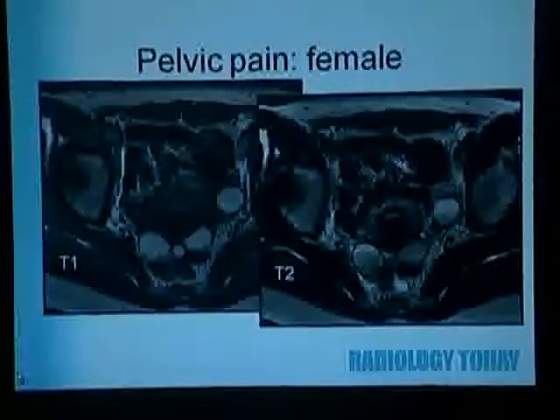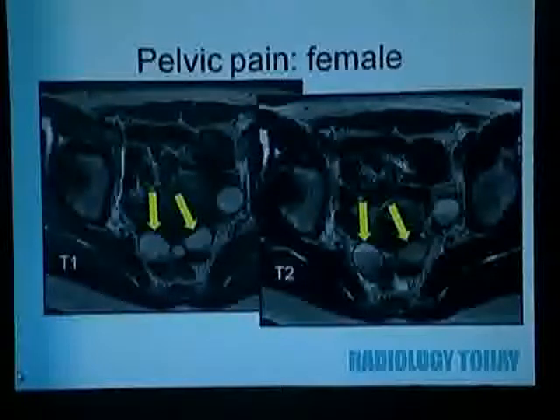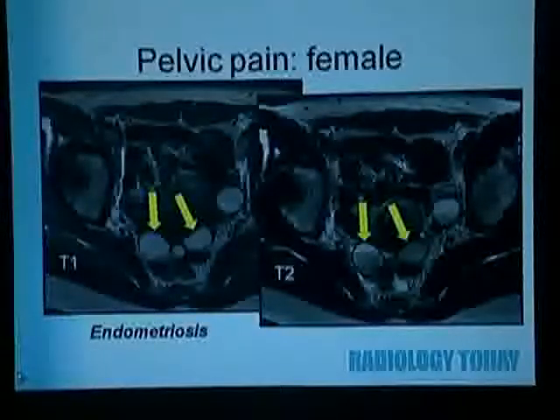So in that case, MRI is indicated to evaluate could this be some benign or malignant neoplasm, but there was suspicion that it was indeed this entity of endometriosis. As you can see from the T1 to T2 weighted images, it's hyperintense on both, but there's a little shading on the T2. It's a little bit darker, and this was endometriosis.